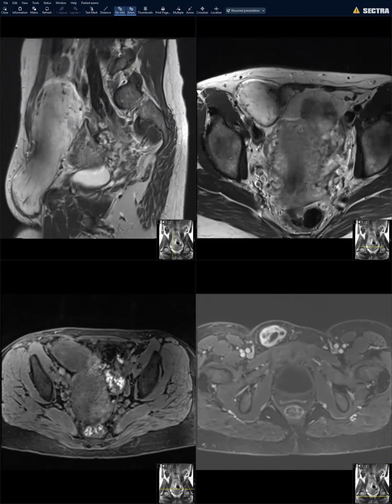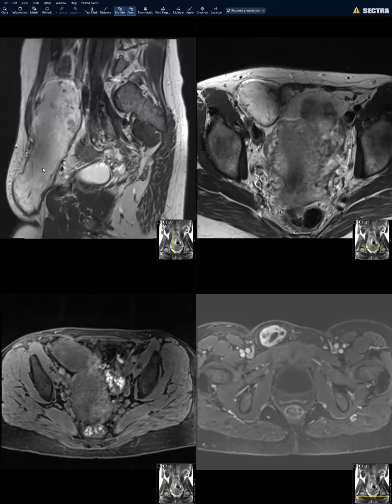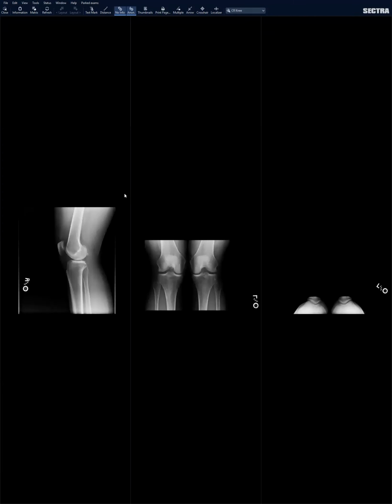Wait, Roopa, one thing. You had just said something about T2 hypointense, but you mean hyperintense, right? Hyperintense, yes. Okay, because that's to me been a surprising finding. You think fibrous, it's going to be hard, but it's not as hypo as you expect it to be, right? Yeah, it's more myxoid looking than true. Oops, we don't look at knees in this conference, sorry.